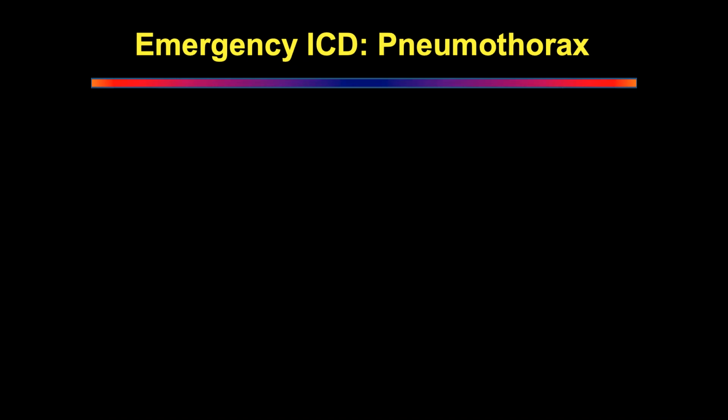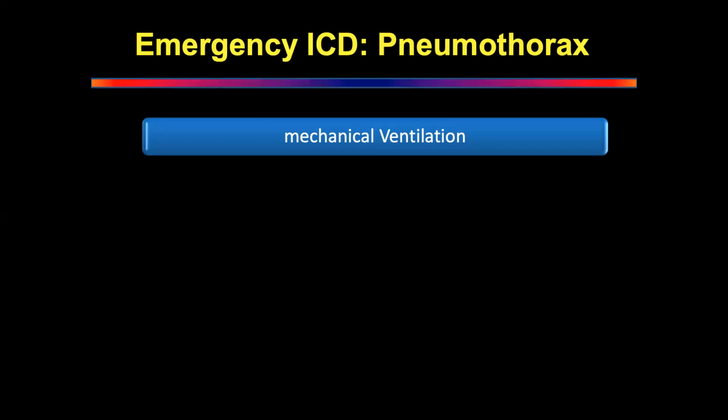A foreign body can also sometimes lead to situations where we have tension pneumothorax. Which is the commonest indication for putting in ICDs in the ICU? Suppose the patient is on a ventilator. Mechanical ventilation, CPAP, positive pressure ventilation. First indication. Agreed or no? Yes, sir. Everything else is okay, but with mechanical ventilation, even if he's got a small pneumothorax, you very quickly go and put in a chest drain.